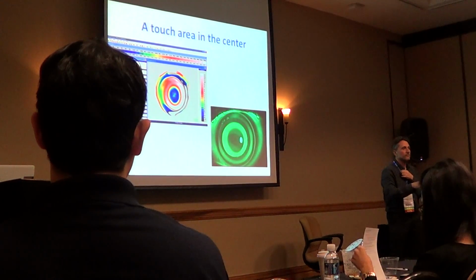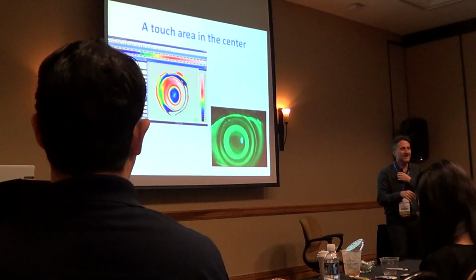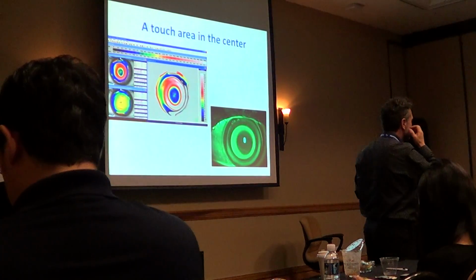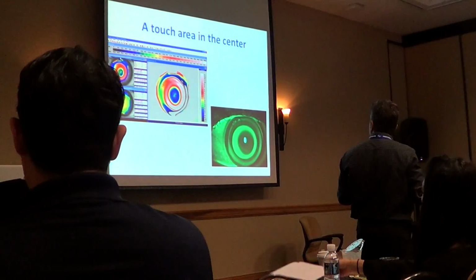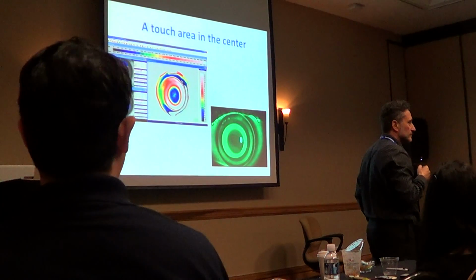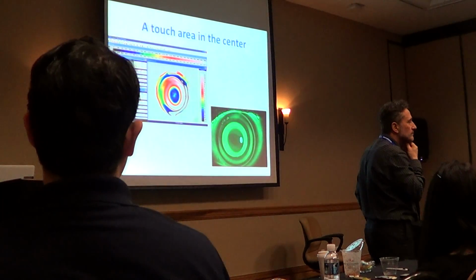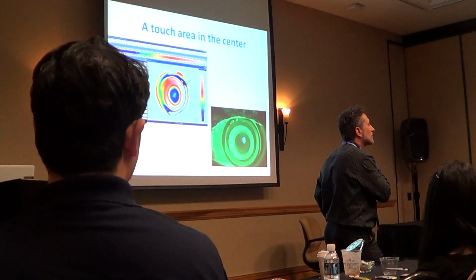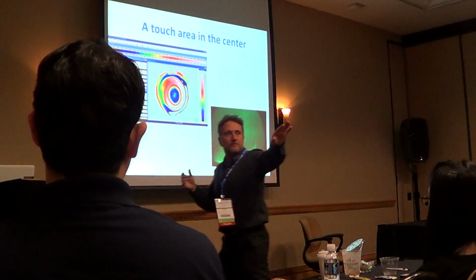Okay, that's right? Jeff? Well, it looks like the treatment zone is pretty well centered. Oh, yes, but we have an under correction zone. Okay, but I'm seeing if the treatment zone is centered, then the lens is actually centering, it's tilted. Yeah, I'm going for your question, okay?